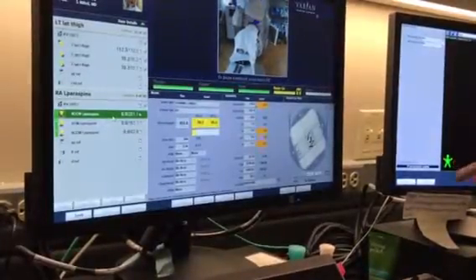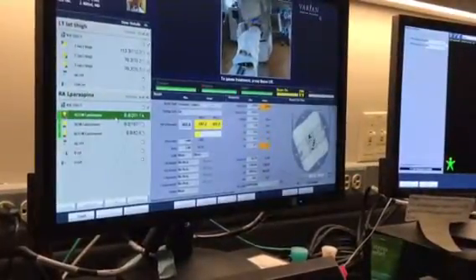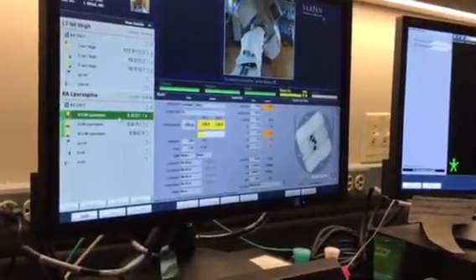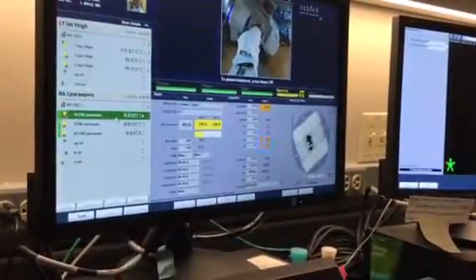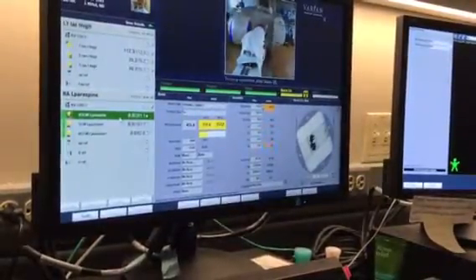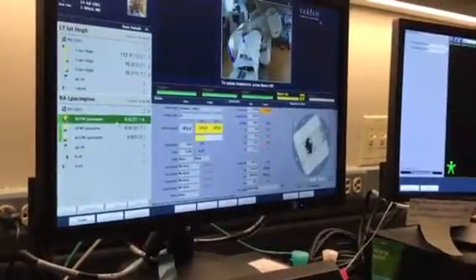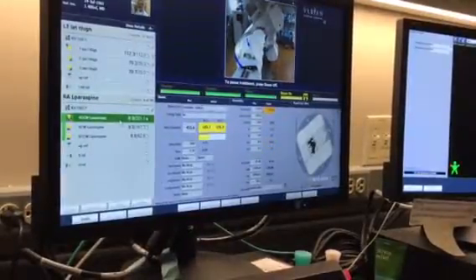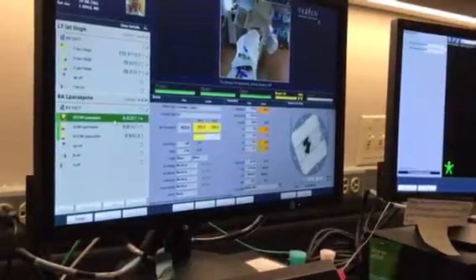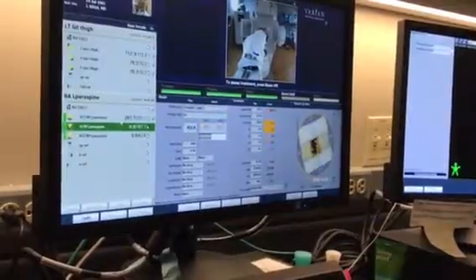All the organs in your body can tolerate a certain dose of radiation, and they call that a tissue tolerance dose. So Dr. Kittle would never prescribe a dose that would even come close to damaging the lungs. Because of where the tumor is, he has to give some dose definitely getting to his lungs, but he's doing whatever he can to minimize it, and he's getting the latest, the greatest. It's called IMRT, which is intensity modulated radiation therapy. So he's using this technique to minimize the dose to his lung, his spinal cord, all those critical structures.